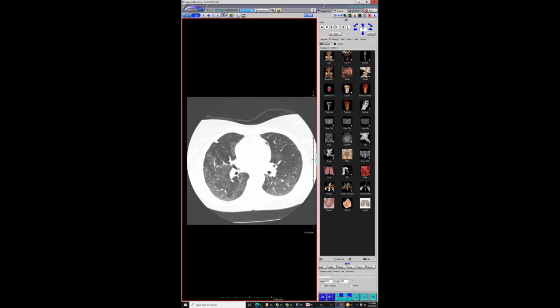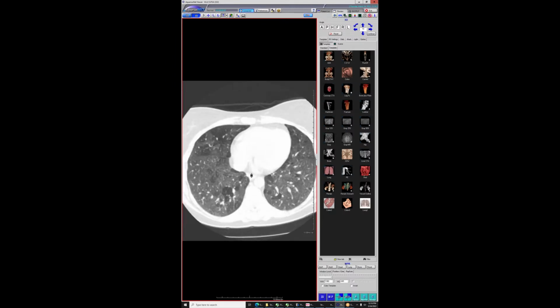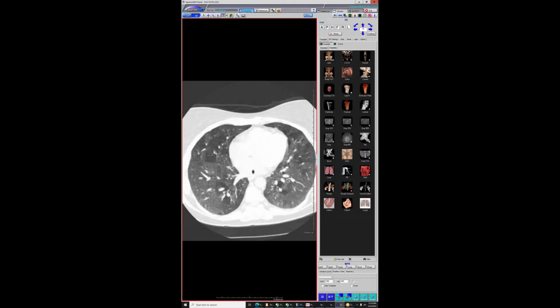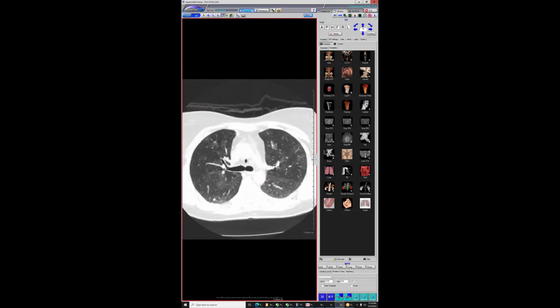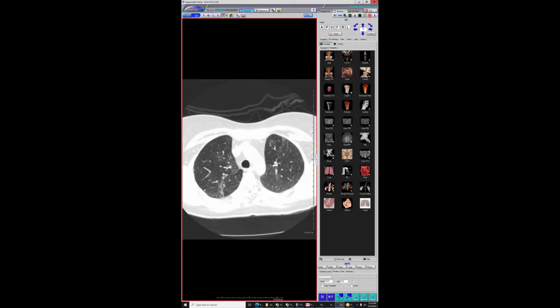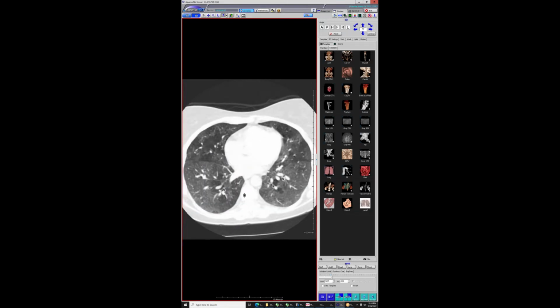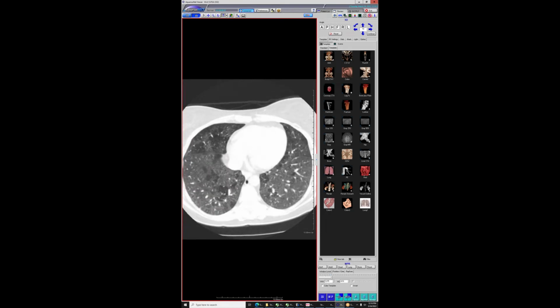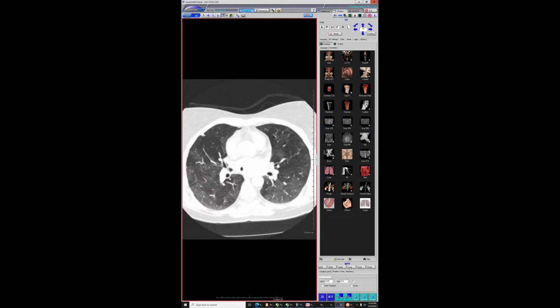There's one before this that shows much worse septal thickening and ground glass throughout the lower lobes. It really looks like some sort of acute lung injury, but there were areas of mosaicism. And when you went to the upper lobes, there were some centrilobular nodules, although not as conspicuous as this, more fluffy, but they were definitely there. So it looked more like an acute lung injury. And at this point, she's already had her biopsy. So this was before that.